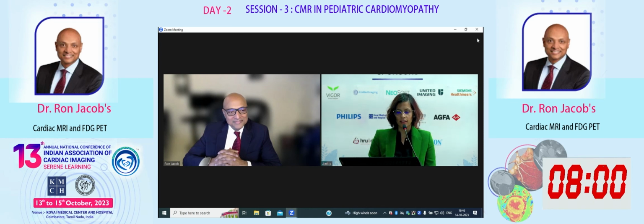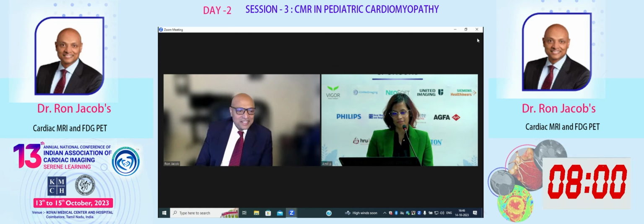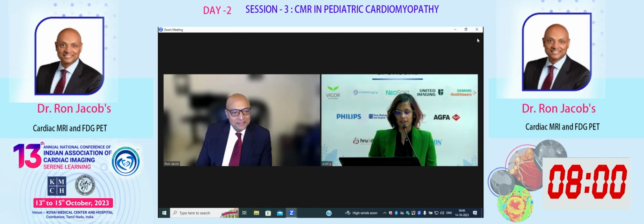So they decided to send him for PET, and that came out positive. Where was it positive? Out of curiosity, which wall was it? Diffuse? No, it was not diffuse. First we told them to get it reviewed by someone we know, so that we know it's not an artifact. It was patchy, and it was not just in the basal anterolateral wall. And there was a small lymph node which took up FDG, and we biopsied that through EBUS, and it came out to be sarcoid.